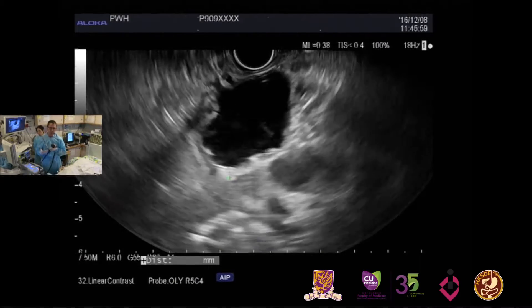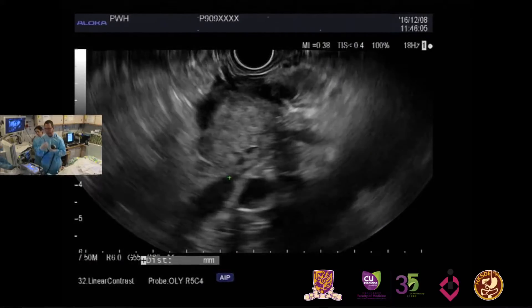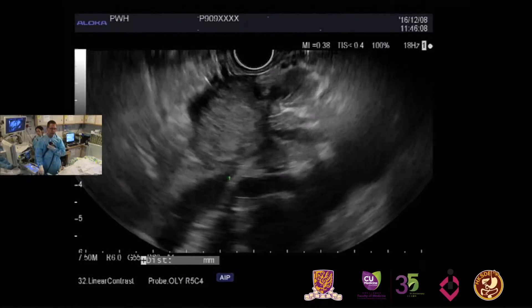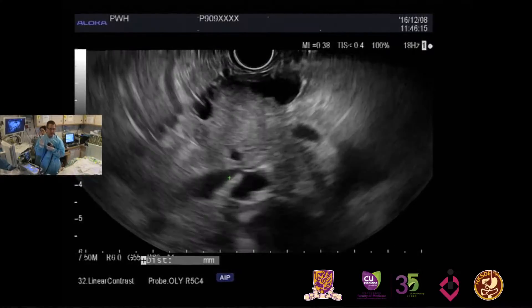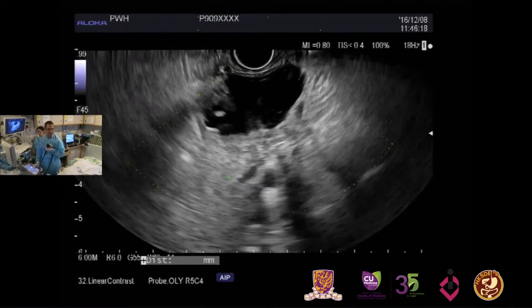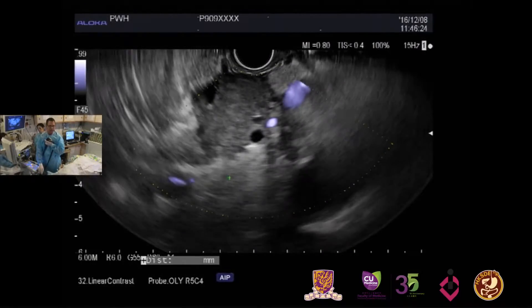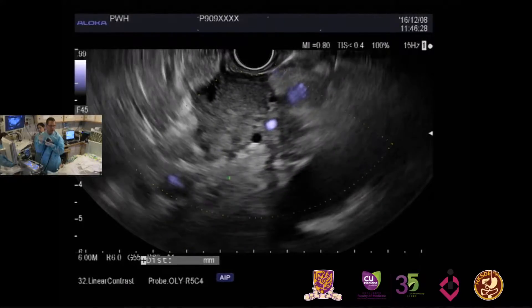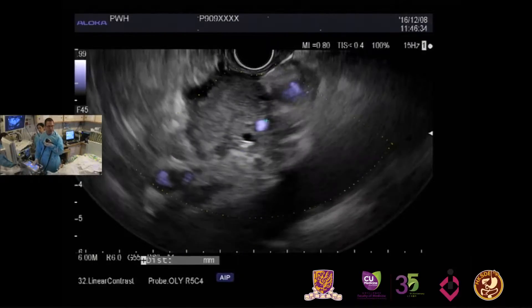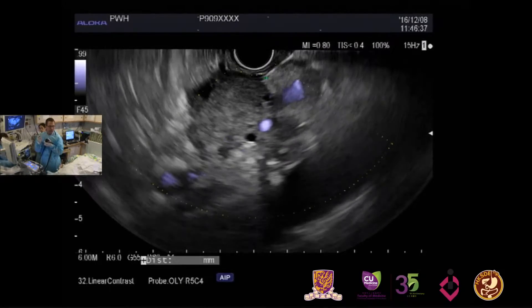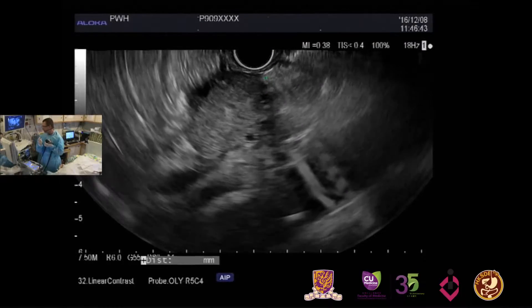Our first goal is tissue diagnosis. We've done one pass already and we'll prepare for the second pass. We're using the Cook 25-gauge needle, which as I mentioned in our lecture two days ago provides the best overall sample. I want to carefully avoid the cystic component due to the slight risk of infection, so I'm rotating the echo endoscope accordingly. We're using Doppler to avoid vessels, and you can see the needle entering the field of view. We simply puncture forward, pull the stylet out completely, and apply suction.